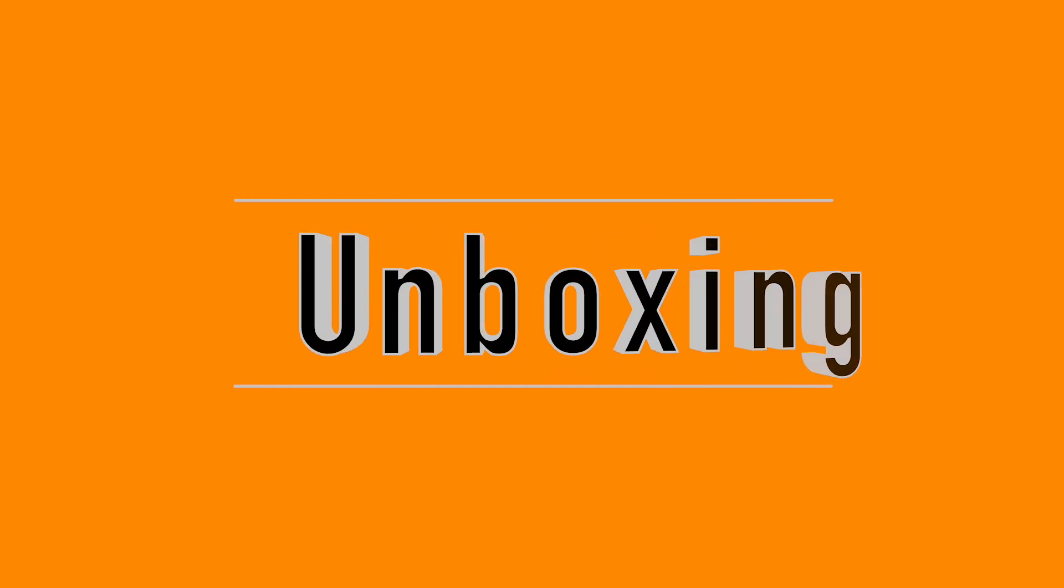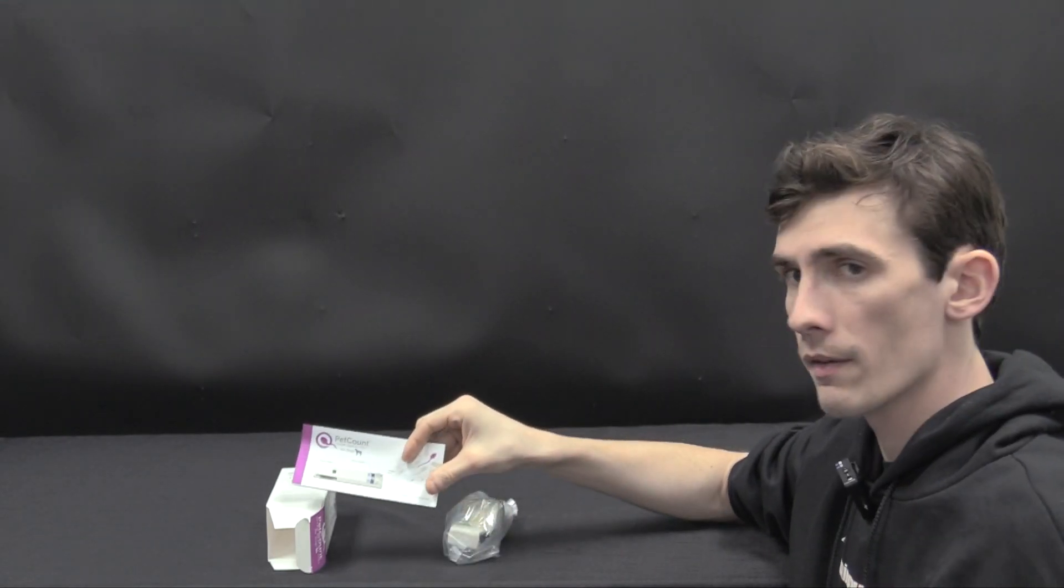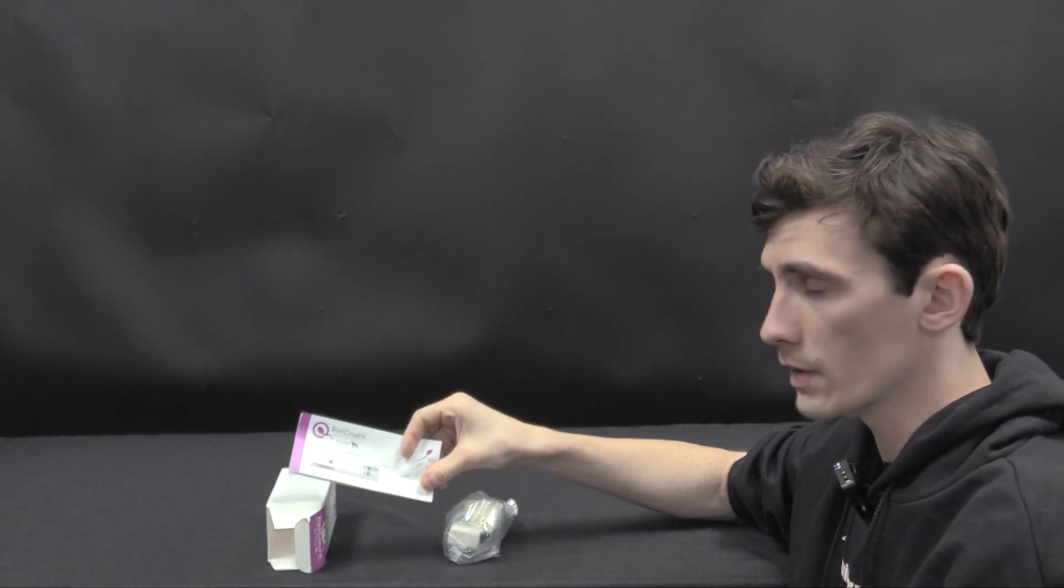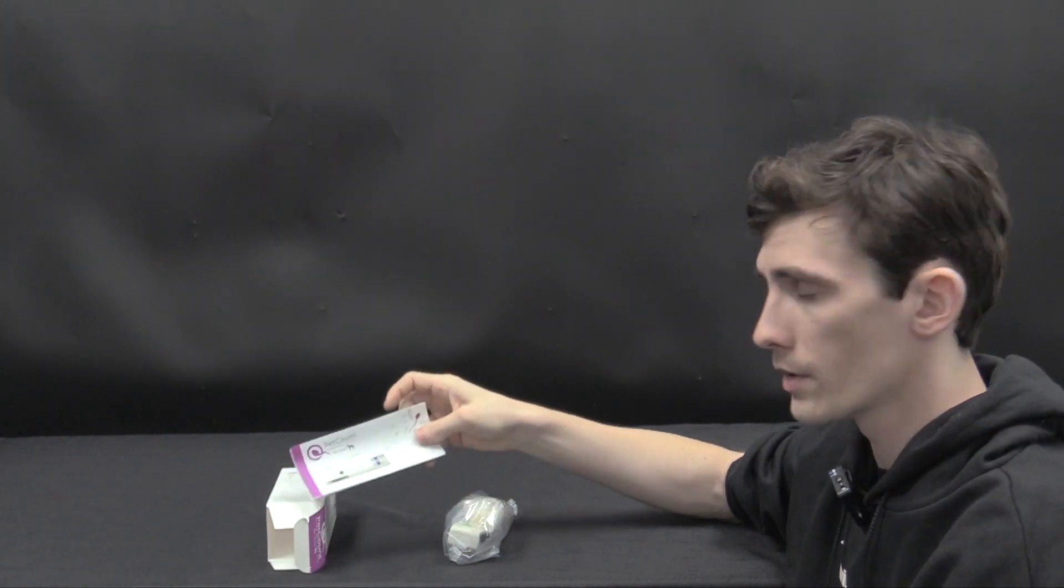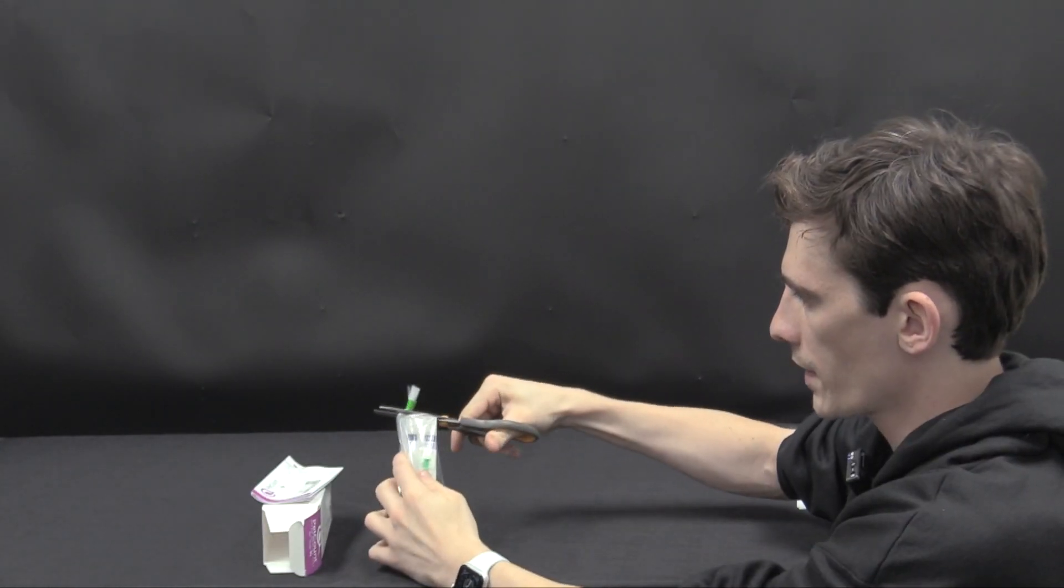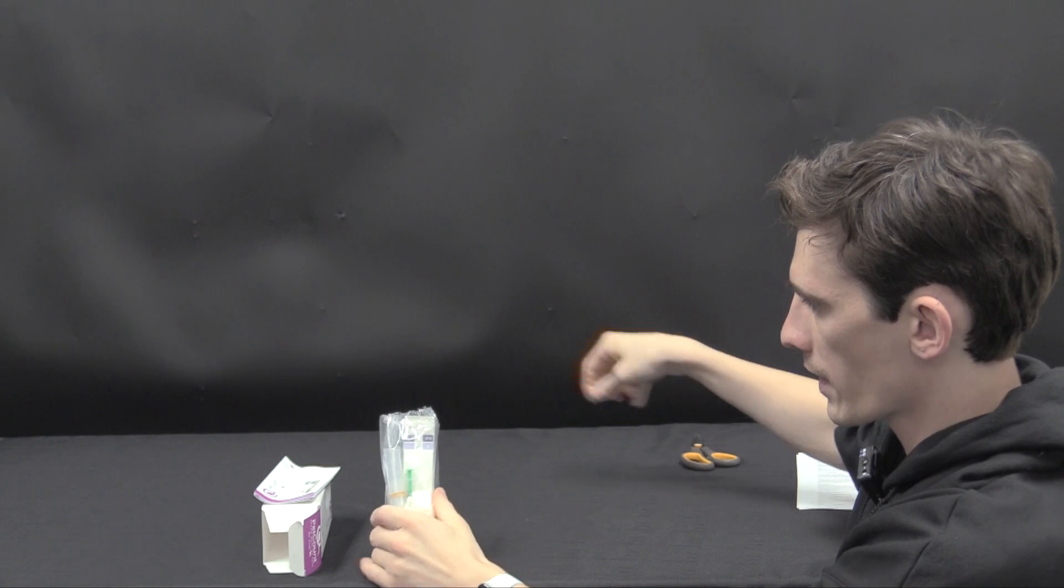Let's open up the package and see all the contents included. Again, this will have everything you need to assess the sperm sample minus your dog. So here we have the instruction sheet. It's pretty simple. It'll give you a step-by-step outline of what to do. Next in the interior packaging we have the rest of the kit contents.